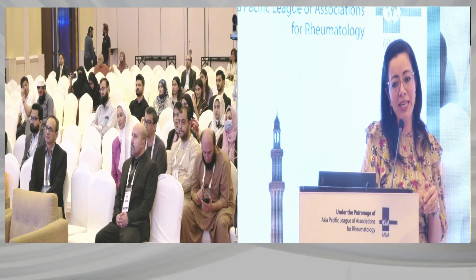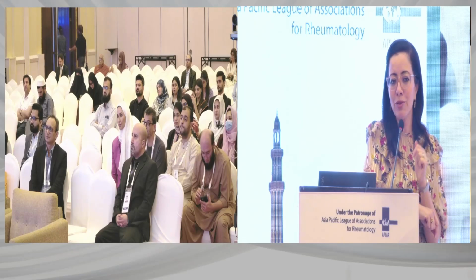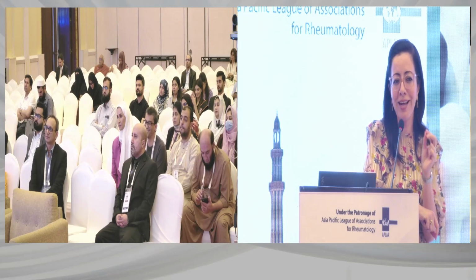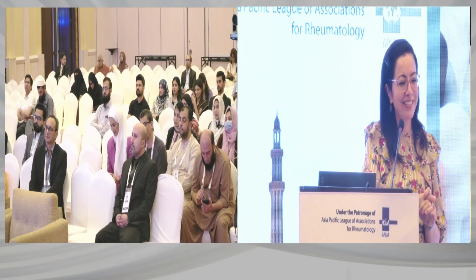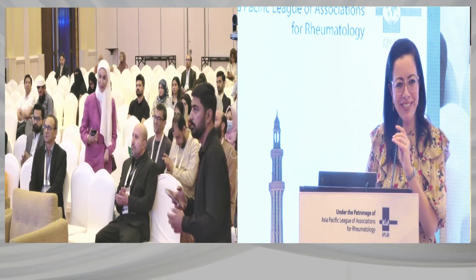I totally agree. And that's why we're not talking about erosions that are seen on X-ray or on CT. We're talking about small, tiny erosions that are only visible on VIBE sequences. So we'll have to find a compromise. This is always the case in imaging. But yes, brilliant comment. Thank you. Thank you very much.